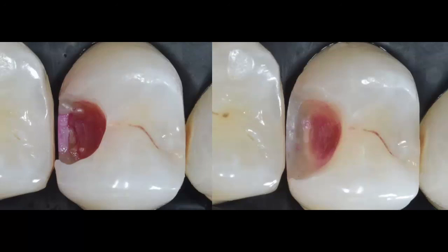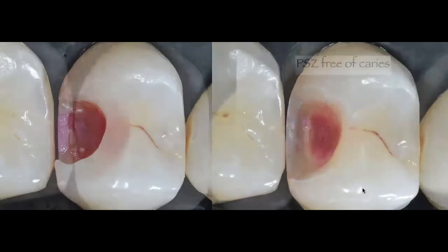And again, just a before and after side-to-side photo where you can see my completed preparation, and that's my tip number one, using that wedge, separating the teeth so that you can create that ideal box without nicking the neighboring tooth. My second tip was using the caries detection dye so that you can identify all these different layers. And my third tip, where can you leave caries if at all needed because of the depth of your preparation. And in this particular case, that's what you're seeing on that final photo, using these 3 different tips or steps that I've shared with you to get from point A finally to point B.